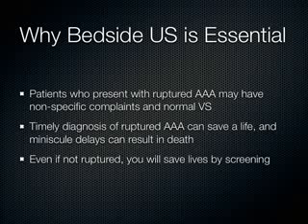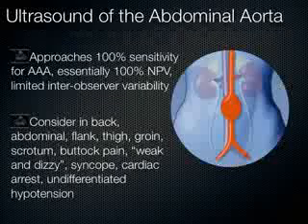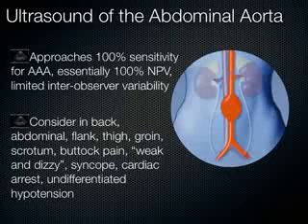So as you move into next year, when you guys are doing physical exams with your ultrasound machines, you may uncover this. And one of the patients you're seeing somewhere precepting, you never know, okay? Just keep in mind that Medicare reimburses any physician who wants to do a screening bedside ultrasound on any patient greater than age 55. Medicare will give you like $22. So think about that, paying your loans off.